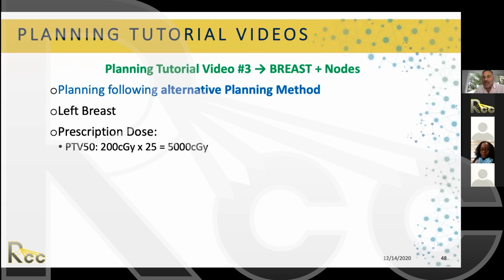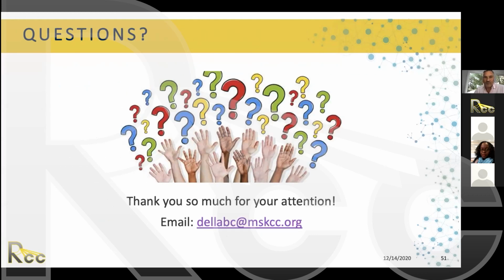Okay. Any question? There is a question in the chat. Somebody has a question regarding head and neck cases, asking that if the volume shrinks during the course of treatment, there's a rule of thumb in the case of forward planning that for every centimeter, there is a dose deviation of up to 3 to 4%. Yes. But what if we're talking about VMAT planning in such cases? What would be the impact of mass variation up to 1 centimeter? Perfect question. So basically it's the same rule of thumb.